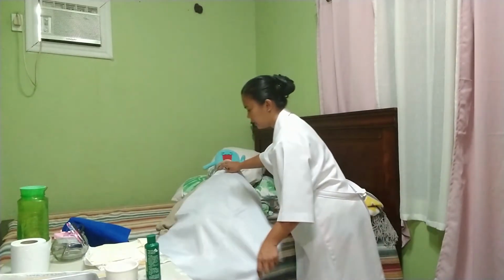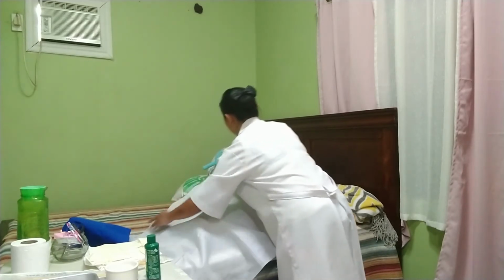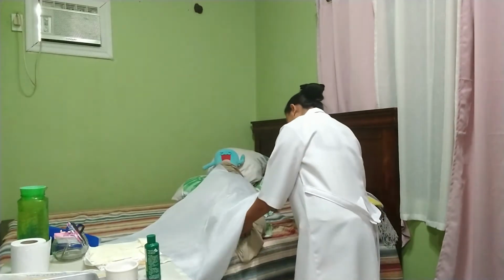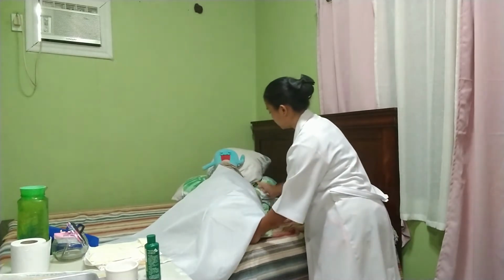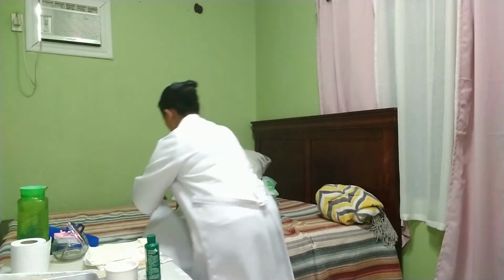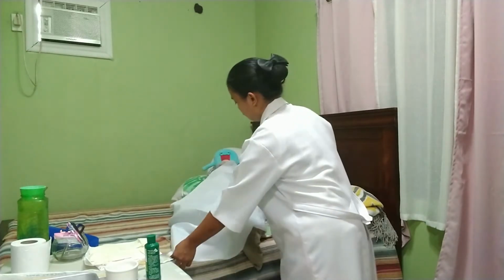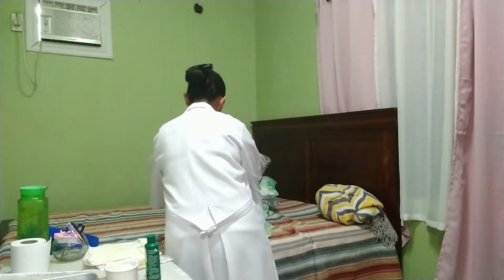So in the diamond technique, we have to put one point of the diamond towards the head of our patient. And then grab one point, wrap it around the patient's leg, and tuck it under the patient's foot. Repeat on the other side. Then fold the lower center point of the diamond to expose the perineum area.